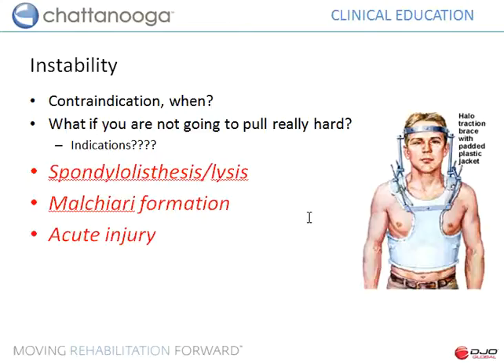So we can basically mimic some of the procedures that have been done in the past for post-surgical procedures, or one of our emergency splints we use for a fractured femur is a hare traction splint, and it's used to provide tension on the femur to decrease spasm for the hamstring muscles. And so it's a very, very similar concept, but understanding that we're not using really large forces, and that's why if we're using that approach to create actually an immobilization, a suppression in muscle spasm, we can actually treat spondylolisthesis and spondylolysis.